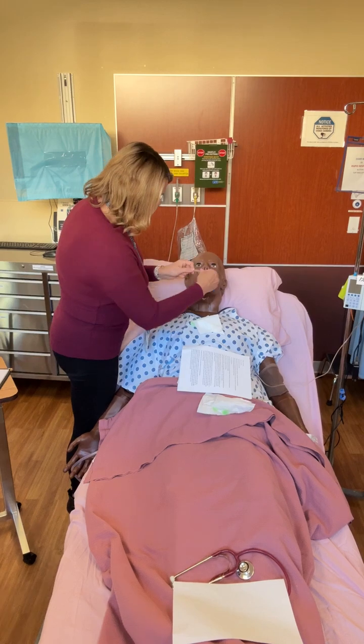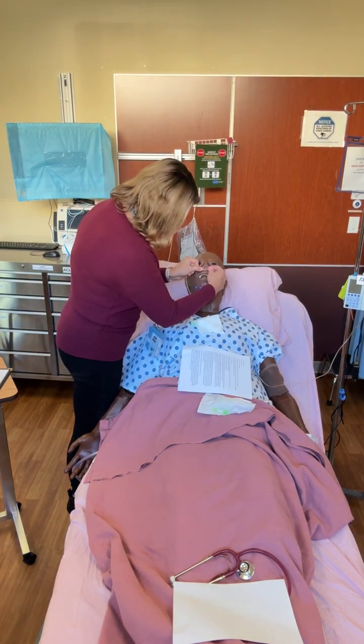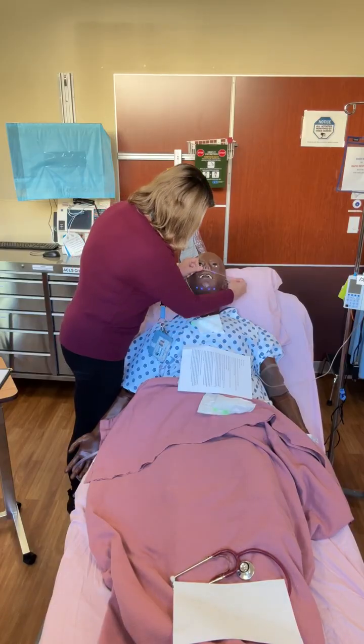Stan, I'm gonna put some oxygen on you. Kind of blue. Not sure if you're sad or if you're just hypoxic. All right, here we go.